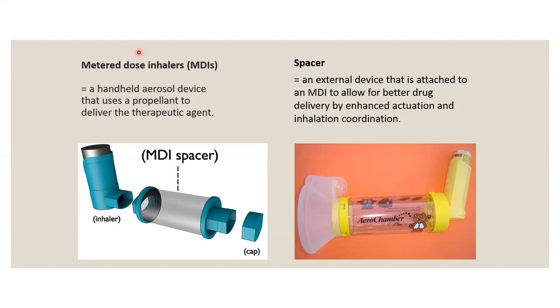If the child is old enough, maybe about 10 or 11 years old, you can actually use an Easyhaler. The concept is similar to the mouthpiece. Then you can even change to a Turbuhaler if the child is old enough and can coordinate. Any other questions about MDI? MDI is quite straightforward.